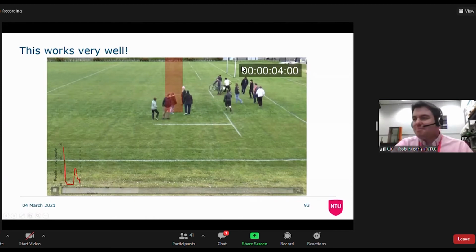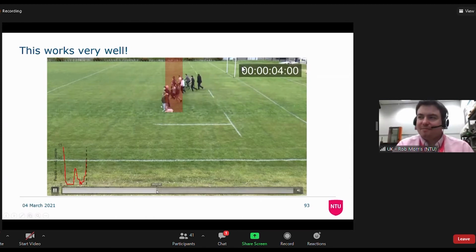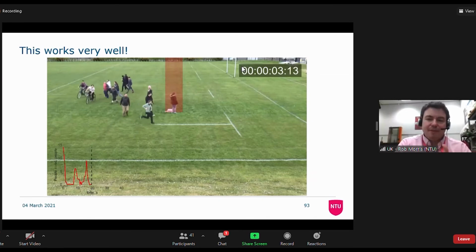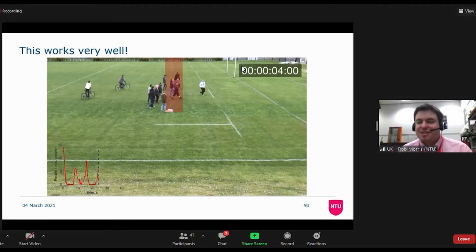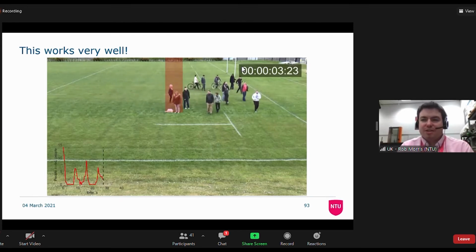And then as people get the hang of it, we'll start to build up beautiful spin echoes each time we're refocused. Now, the idea here is we can do exactly what we did with the gradient echoes, but this time with an extra 180-degree pulse. And that's going to give us a completely different way of visualizing our system and a completely different way of collecting our images. And it opens up a whole new area of pulse sequences for us.